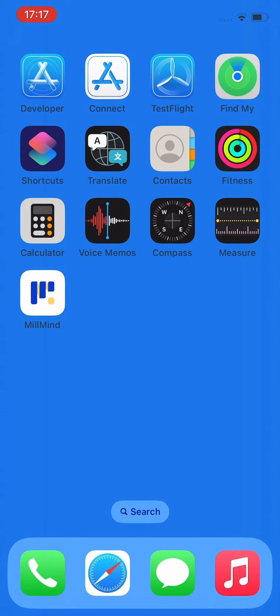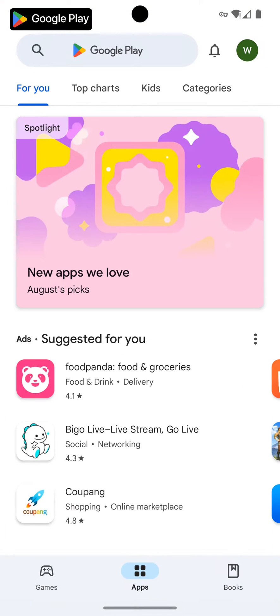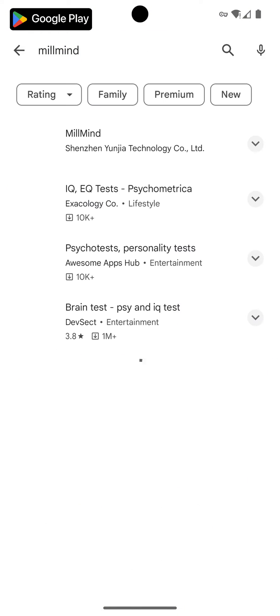The first time you use our software you need to install it. In this video we'll show you three ways to install it. Take a normal Android device and open the Google Play Store, enter MillMind and click search.